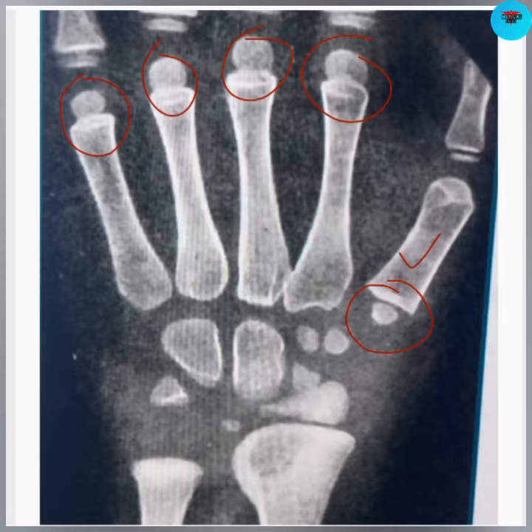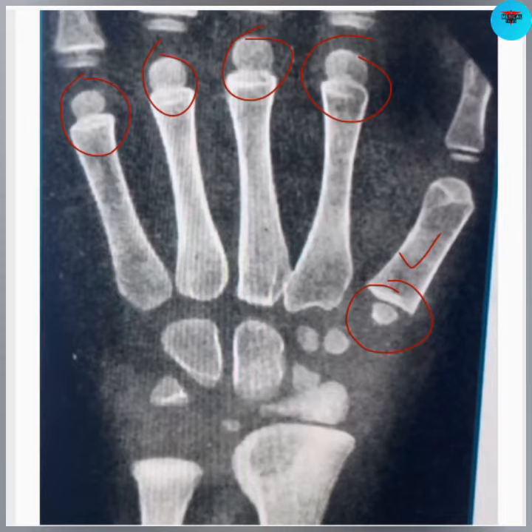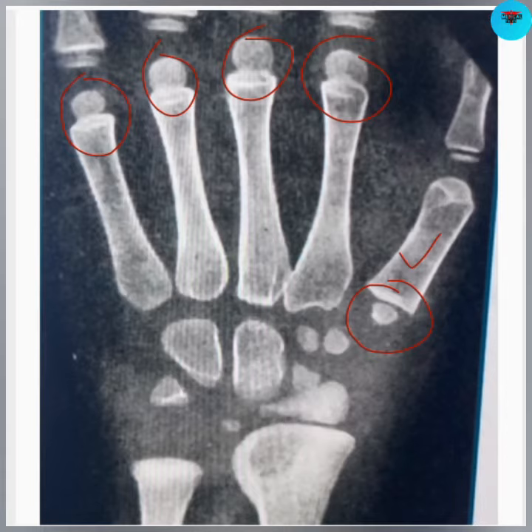This first epiphysis makes the base for the first metacarpal, whereas other metacarpals' epiphysis make the head of their metacarpals. These metacarpals are formed from two ossification centers: the first ossification center occurs at the ninth week of intrauterine life, which forms the shaft, and the second ossification center appears at two to three years of age.